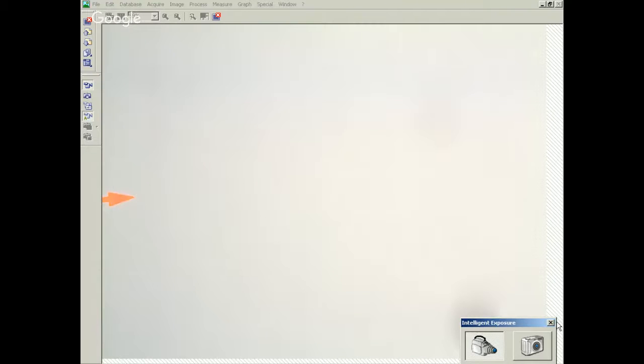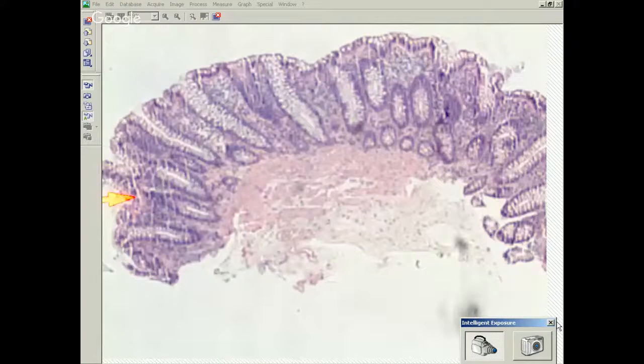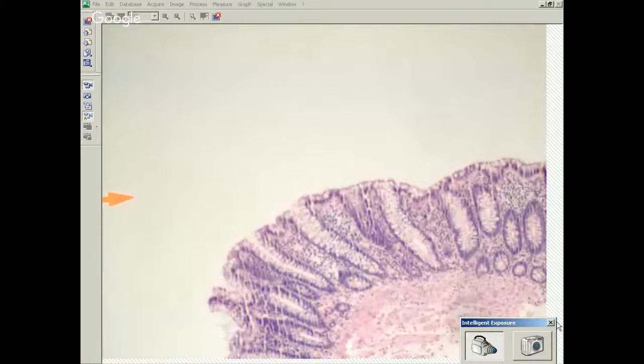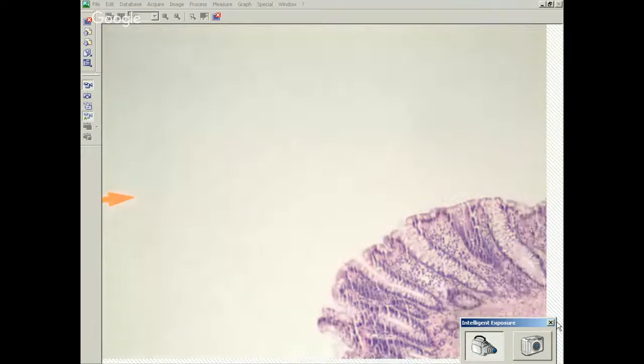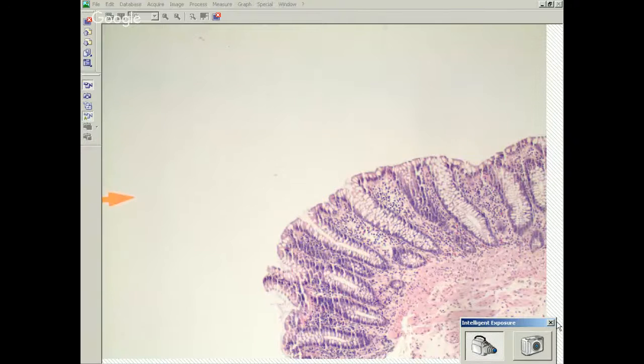This is a 60-year-old male with HIV and diarrhea. The colonoscopy actually looked normal for this patient. All right, this is actually fairly subtle if you aren't used to looking at colon. Any ideas? This looks like normal mucosa.